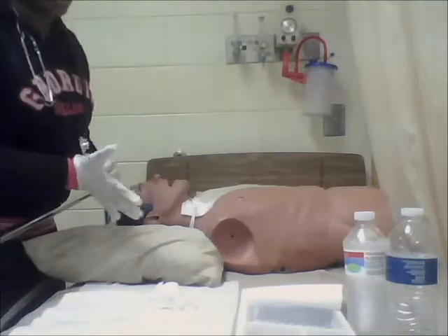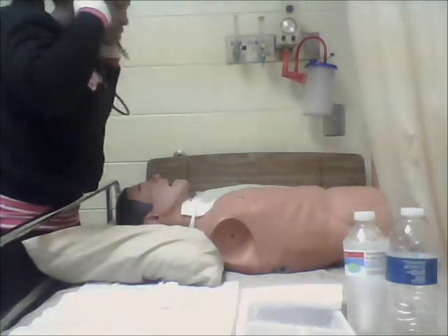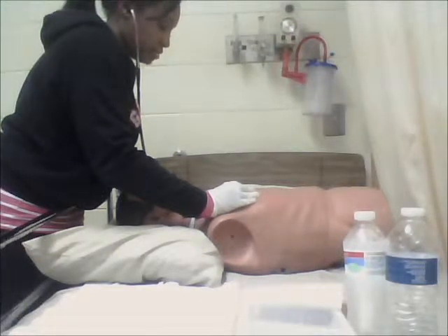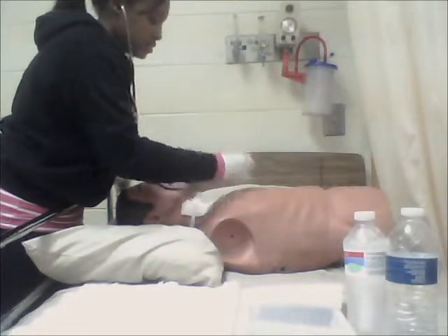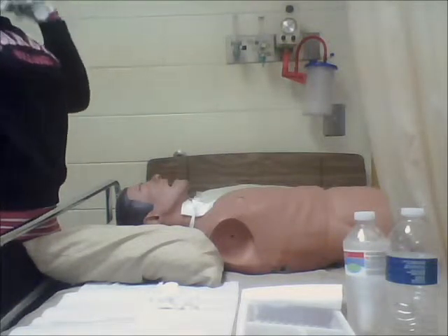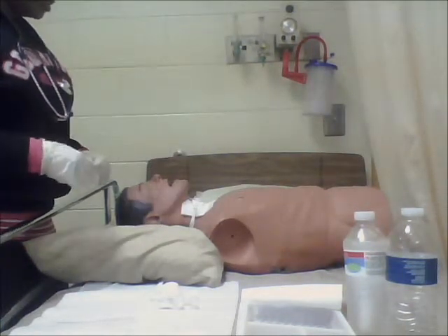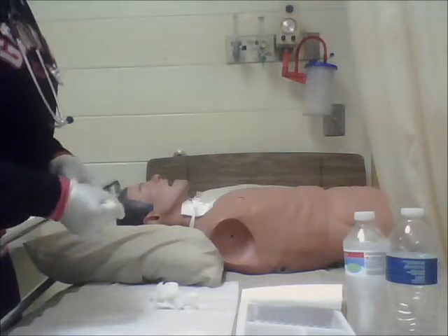Now I'm going to reassess the patient. I'm going to check breath sounds, respiratory rate, heart rate. Make sure that the trach hasn't moved down. And also check the CO2. Just check anything that I think that I need to check to make sure that the trach is in its right position. Everything seems fine.